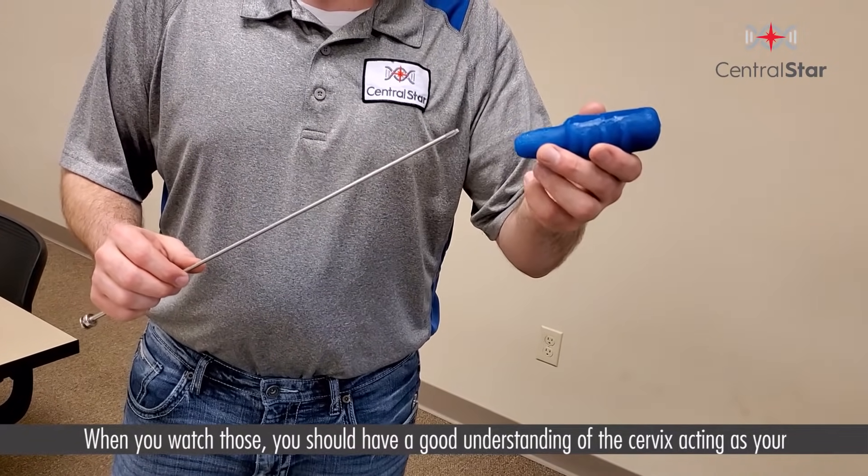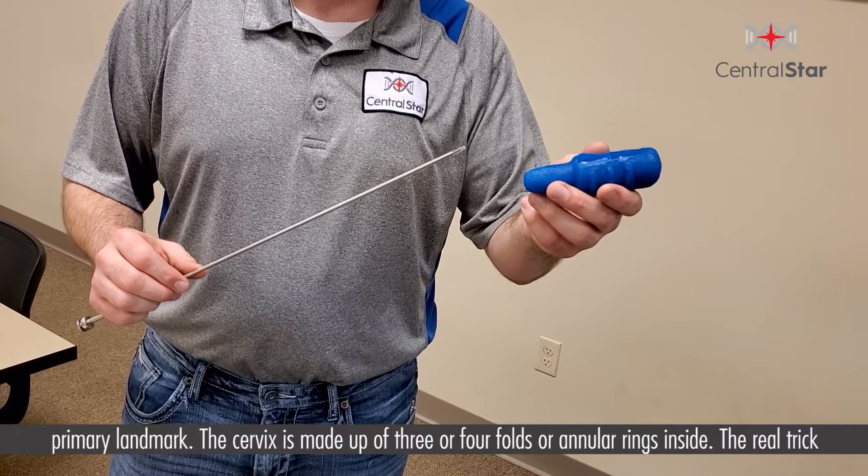From those videos you should already have a good understanding of the cervix acting as your primary landmark. The cervix is made up of three or four folds or annular rings inside. The real trick of learning how to inseminate cattle is learning how to master and maneuver this body part. Beginners want to thread the AI gun through the cervix, but we train that you should place the cervix and maneuver it, placing it over top of the rod. You have to work the cervix, bending and maneuvering it through each of the folds or annular rings. You will hit some dead spots, and sometimes you have to back up to go forward, but ultimately you're trying to get the cervix placed over the rod and the rod out the other end.